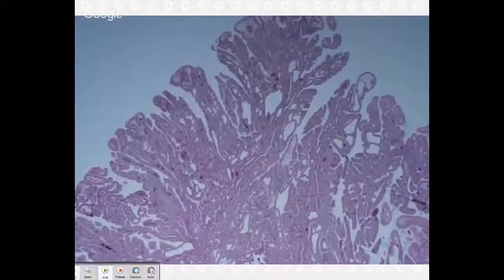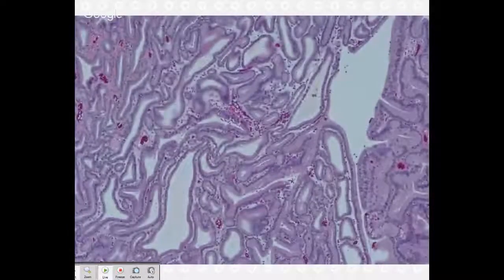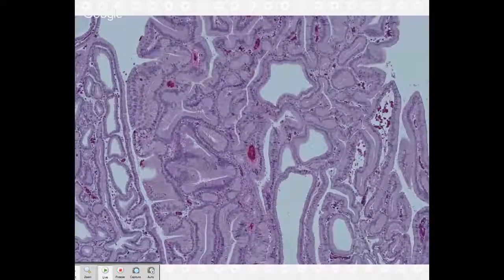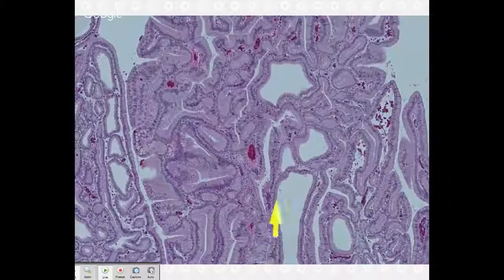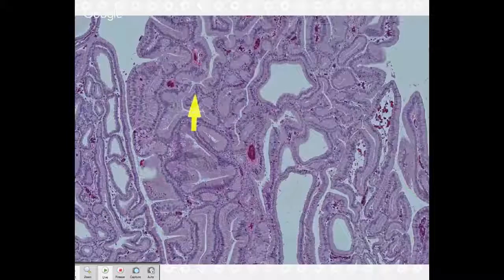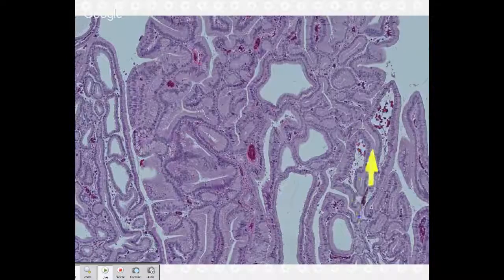And if you go up, here's the same lesion, right? Let's go on a little bit higher power. This one's a little bit pinker. We used a little bit more eosin in this lab. But otherwise, looks exactly the same. I could switch out these two, and they would still have the same abundant pinky purple ground glass. It's a little bit opaque, but almost like you could see through it.